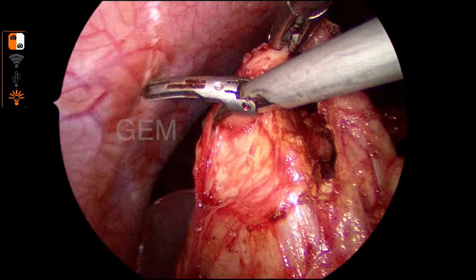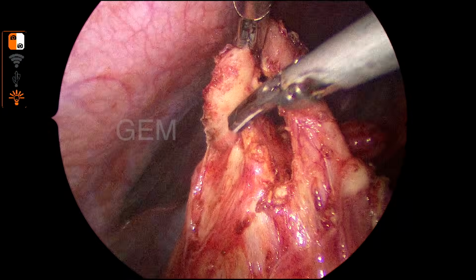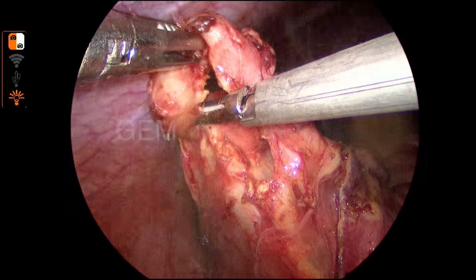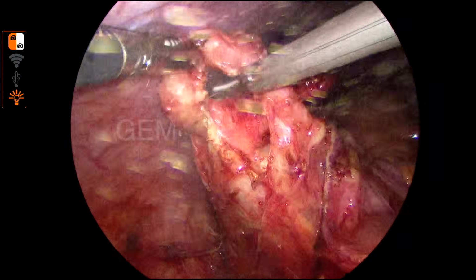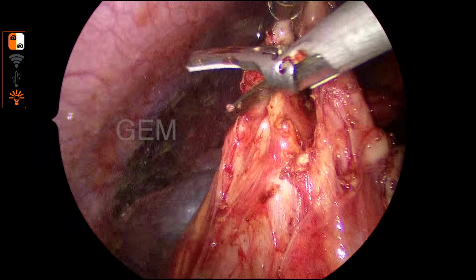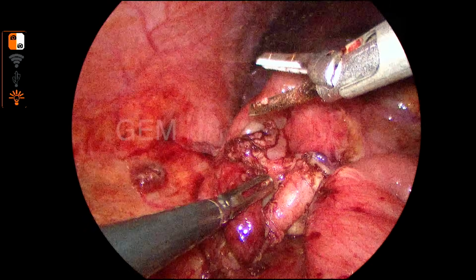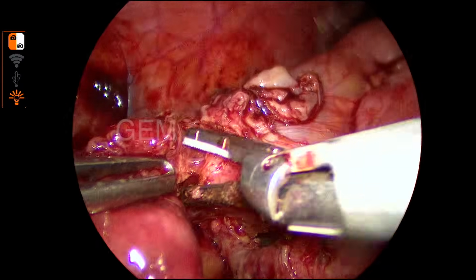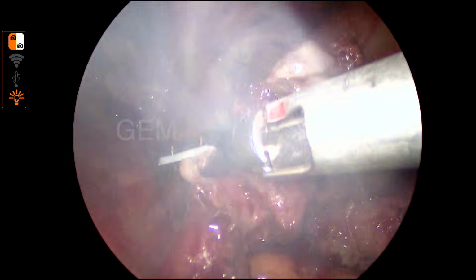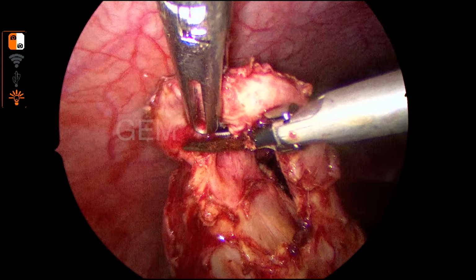You can do sharp dissection with the scissor. You can go close to the appendix, and you can see how much I pull the appendix. You can see the cecum is touching near the abdominal wall. That much I mobilized posteriorly, so that injury to the cecal wall is unlikely. Otherwise, if the posterior is not mobilized, it will open up. So I am dissecting with my harmonic blade, and then I am dividing it, because I know that some portion of the mesoappendix is there. So injury to the cecum is not possible by dividing the mesoappendix like this.